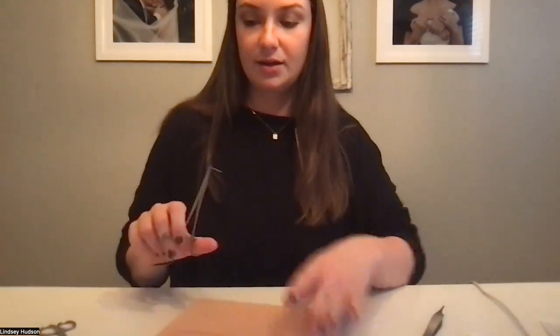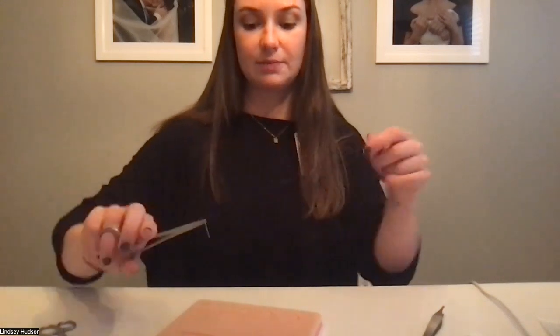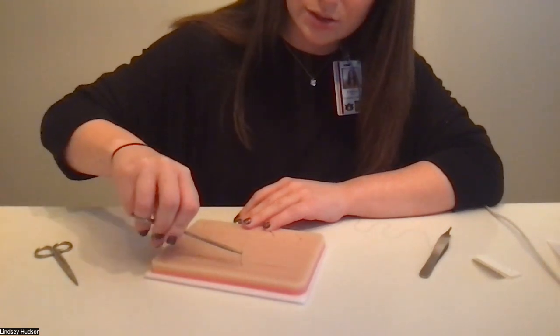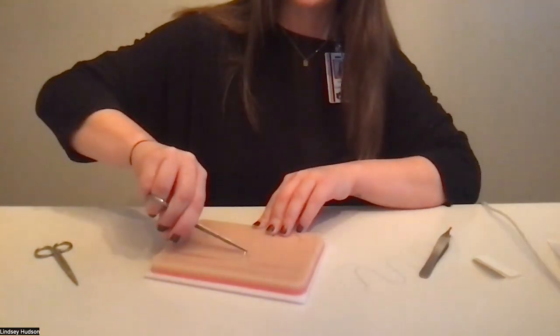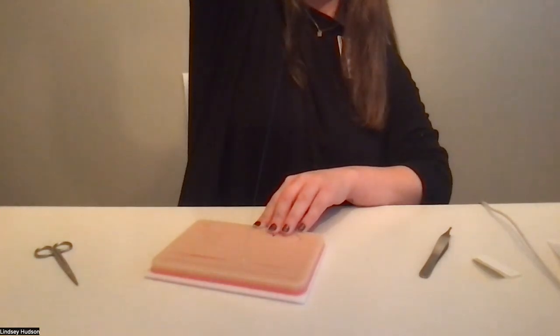So the way that you go in is you're going to start on the outside of the wound. You go down in a 90-degree angle, and you twist your wrist in that motion to kind of pull the needle through to the other side of the skin. So you're going to go into the wound. You're going to twist and come out to the other side. And you're going to pull this through and leave yourself about a 1.5-inch tail.